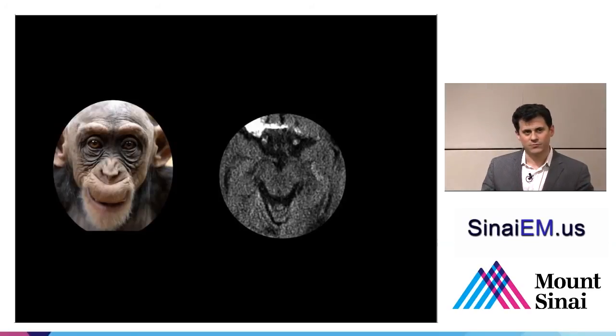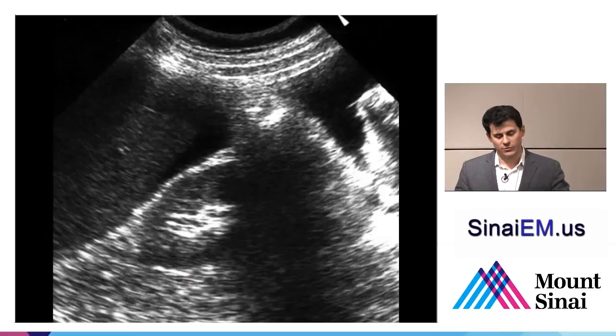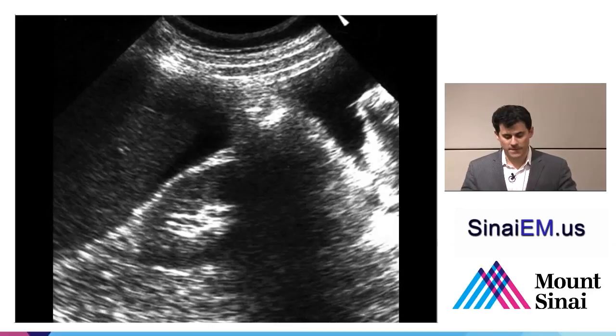And instead, it really makes me think about artifacts as we move forwards, especially as my interest is ultrasound, and what images do to the way we perceive them. So let's have a look here at an image of the right upper quadrant. This is a patient who was suffering a pretty significant blunt trauma, and we can see dark blacks and we can see bright white, so there's good gain on here.